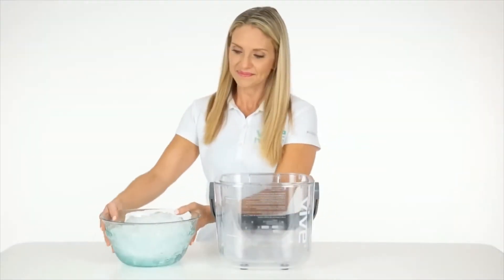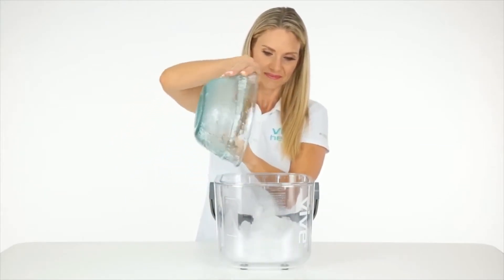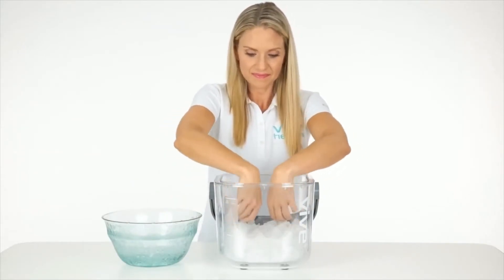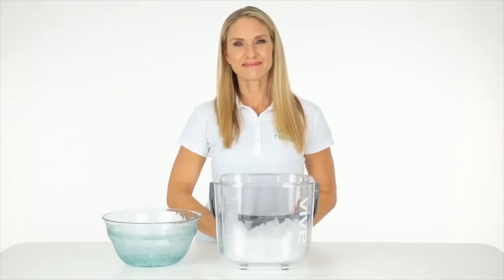To start, add ice to the bucket. Make sure that the ice is level inside and that it reaches up to the ice fill line. If it doesn't reach the fill line, the device may beep to let you know that more ice is needed.